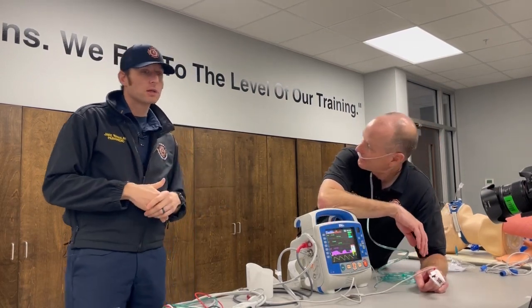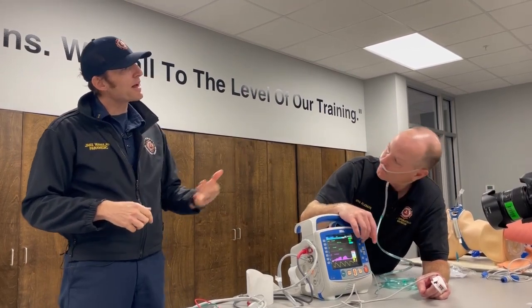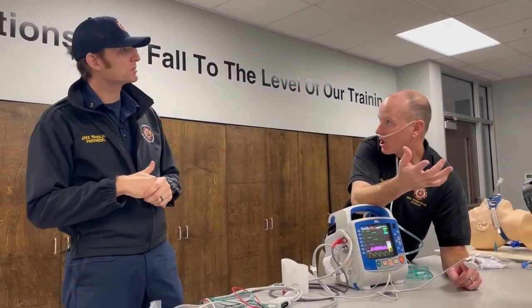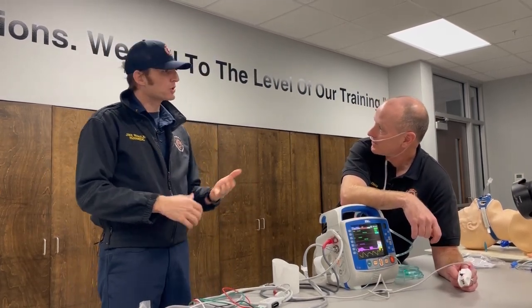It totally is. So we're playing worst case scenario here, right? Can those devices fail? The end tidals? Oh, totally. But once again, this is just a tool to help assist us. We're still going back and checking all the breath sounds, no epigastric sounds. We're going through our DOPE acronym. If all of a sudden this goes off, we're saying, is it displaced, obstruction? Do I have a pneumothorax? Did it go into the esophagus? And you went the exact route that I wanted you to go. So, yeah, it's all context.